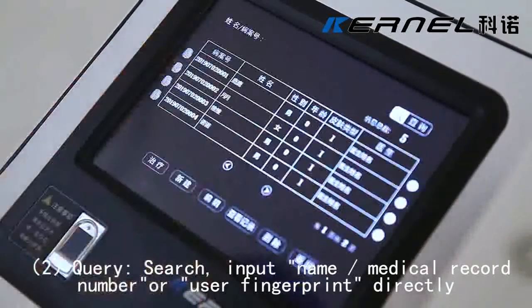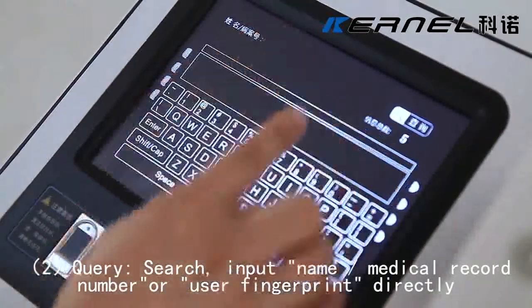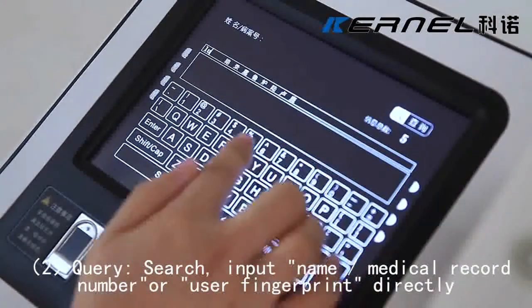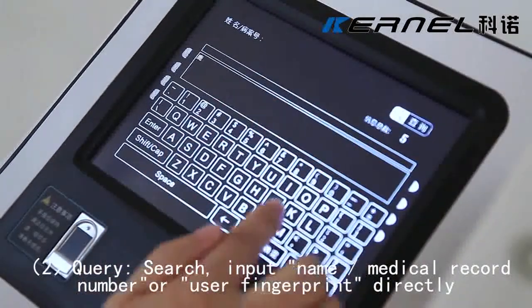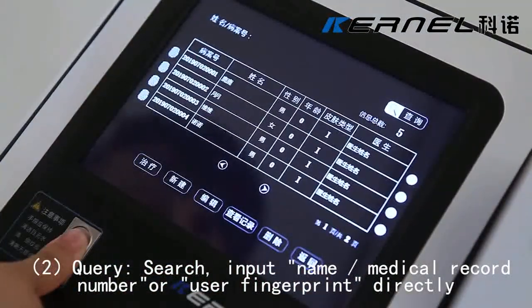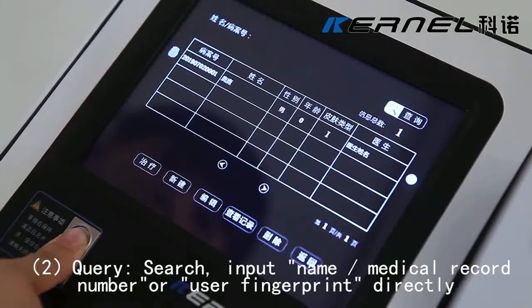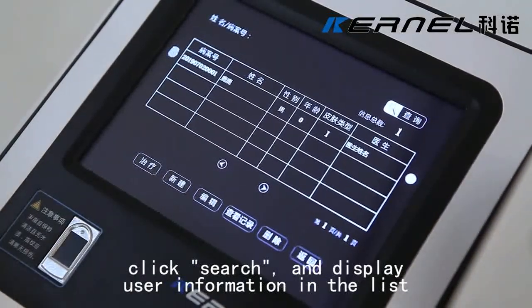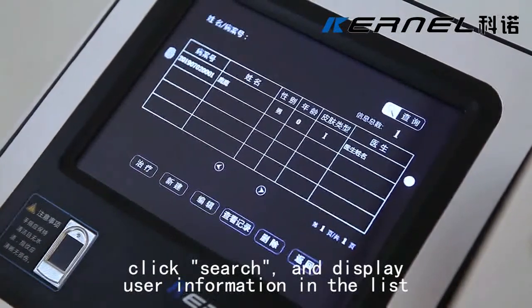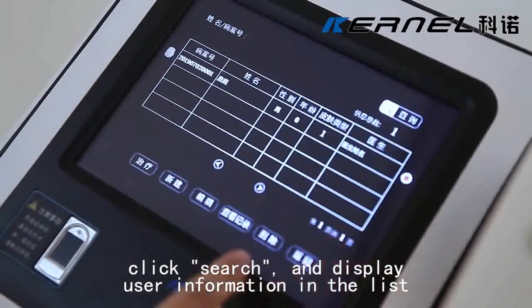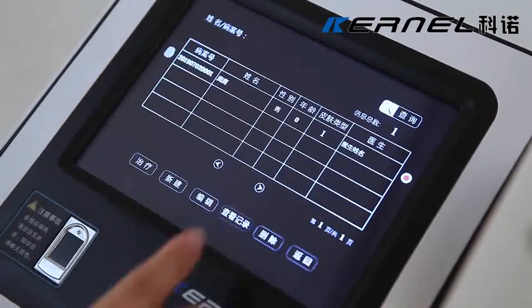Query: Search by inputting the name, medical record number, or user fingerprint, then directly click Search to display user information in the list.